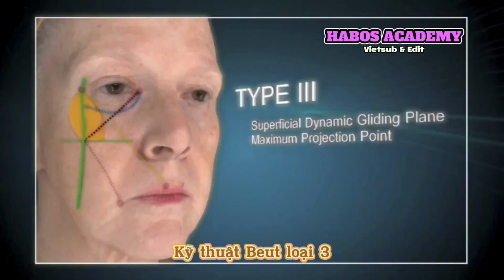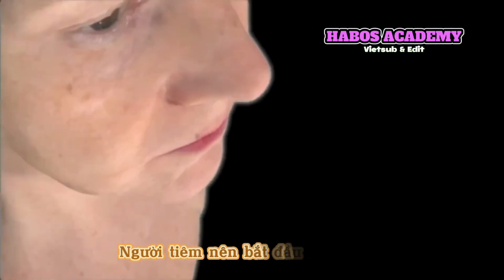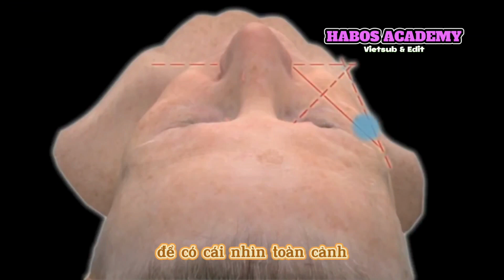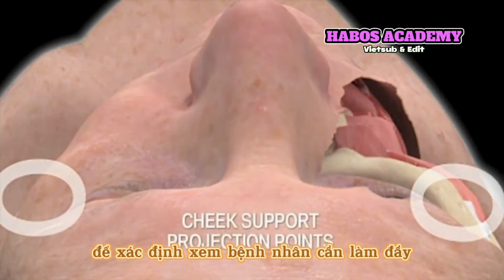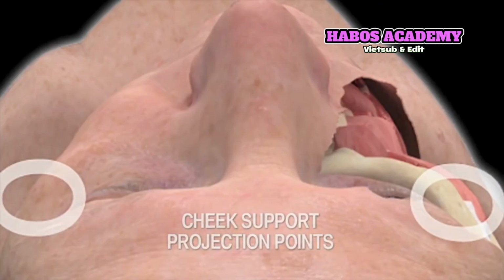Boot Type 3, lateral cheek projection and volumization. The injector begins by positioning themselves behind the patient to get a bird's eye view. Pre-procedural observation and analysis must determine if the patient needs cheek volumization or increased projection of the lateral cheek.